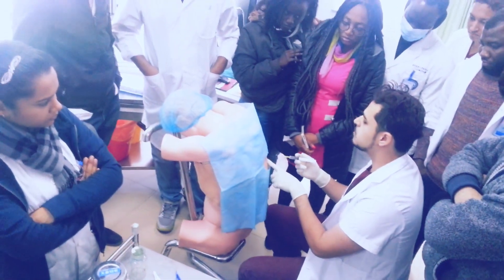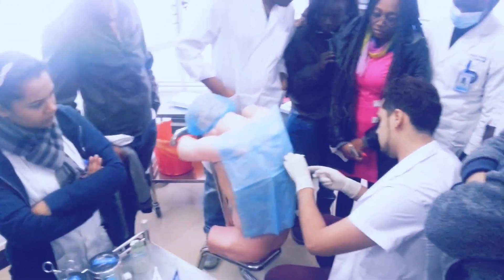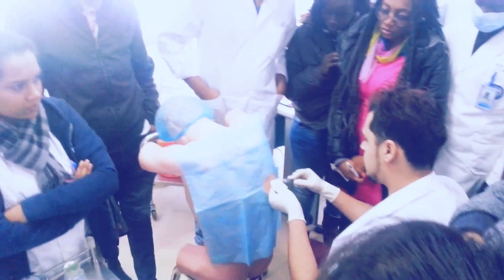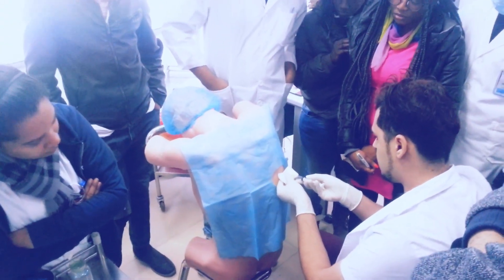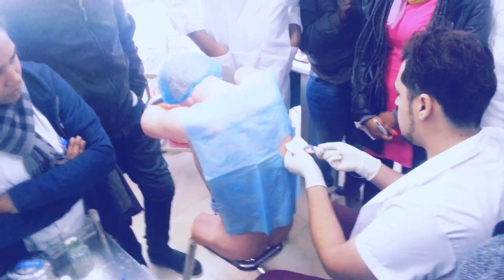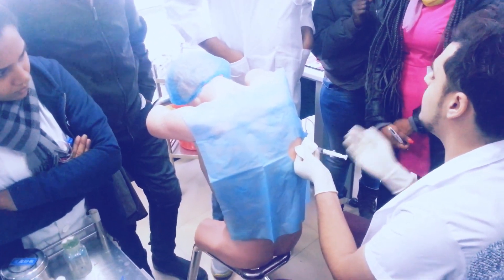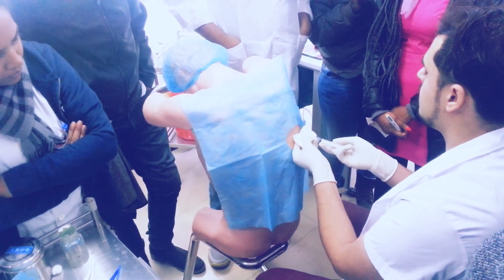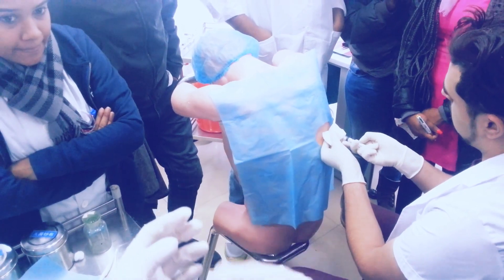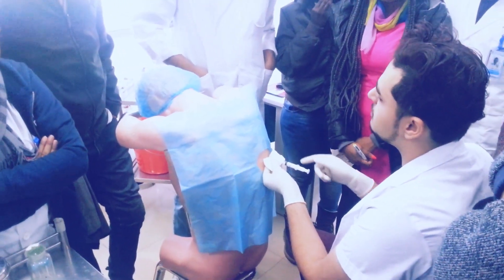Here I have not marked the area, but mostly you will have marked the area already from auscultation and percussion. This is the lidocaine — first you will do the skin, a little bit in the skin, then it will go in. It should be on the upper side of the rib, not the lower side, because the lower side mostly has arteries. So when you are pushing the needle in, you push the injection a little bit in and a little bit out, then push it in again — because if you go into the arteries, the blood will come out, and then you have to pull the needle back, otherwise you will cause hemothorax.